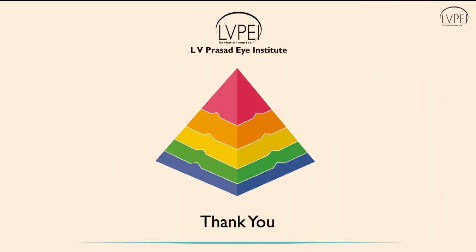Thank you, Dr. Mal. I think you have covered it very well. What she says is that between 1 to 6 months it is difficult because you get the complications. But what is discussed today is that after 6 months, when the axial length of the patient is more than 17 millimeter, in such cases you can go for the IOL.